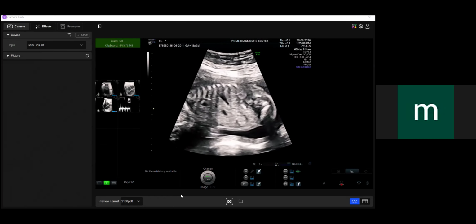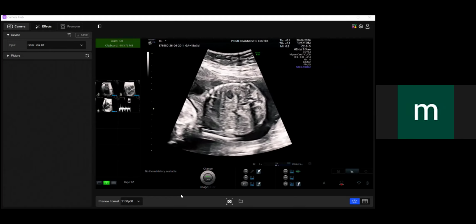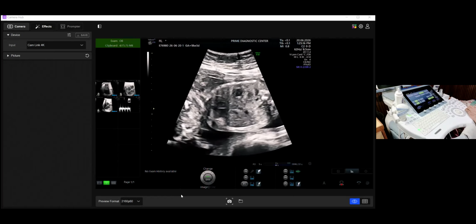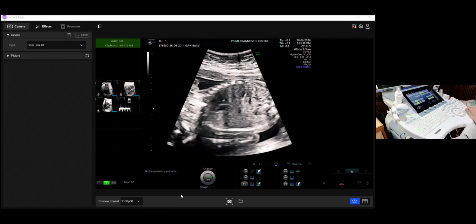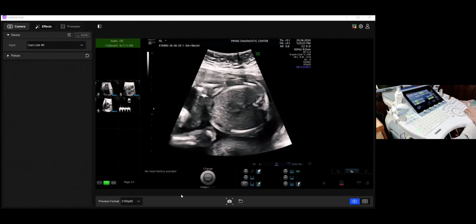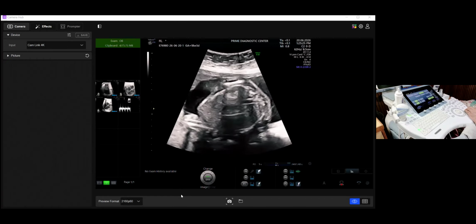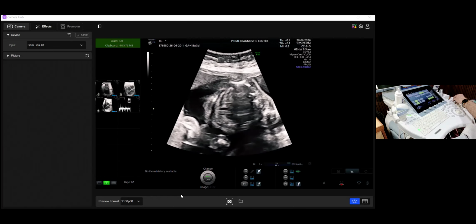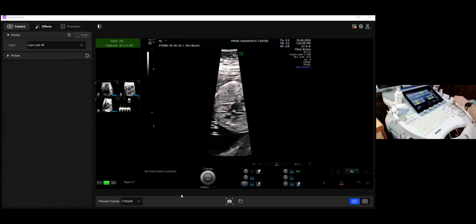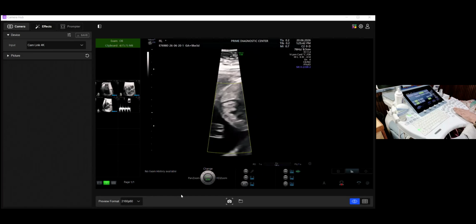Systolic and diastolic function on M mode. Okay. Let's target that first because that's the lateral view. Zoom is very important there. You wanted an M mode, right? So zoom is a very important component of M mode. You should zoom the view.